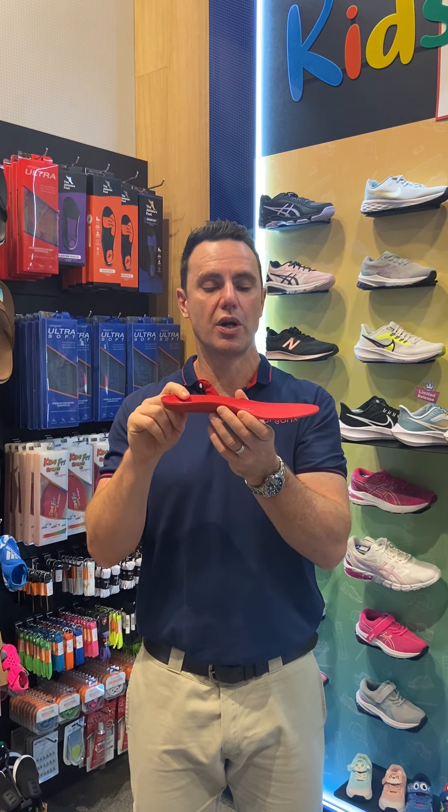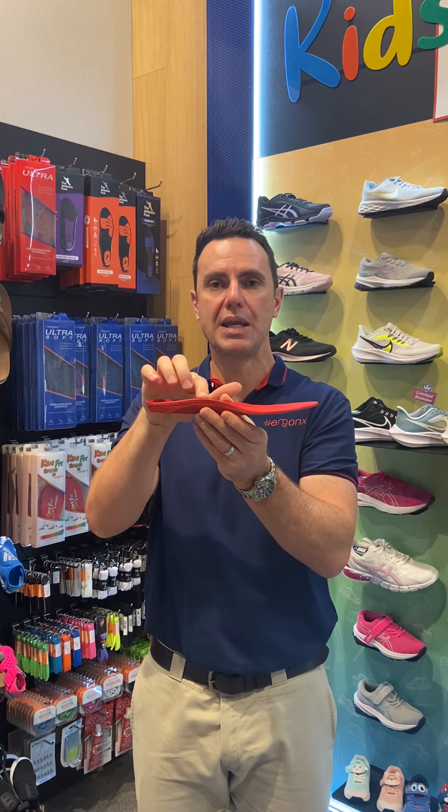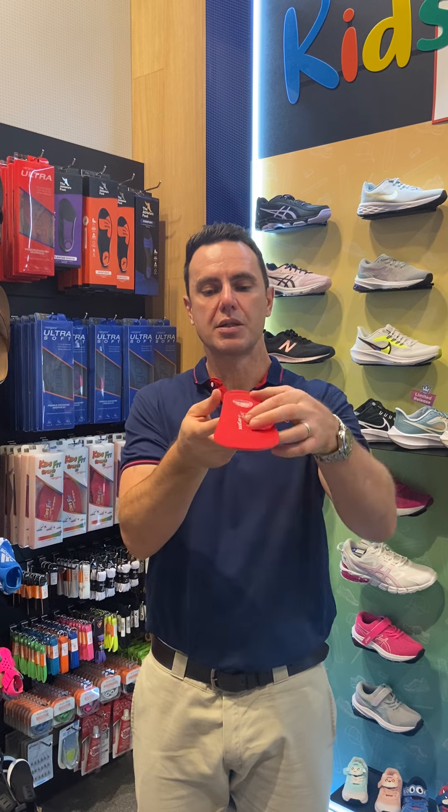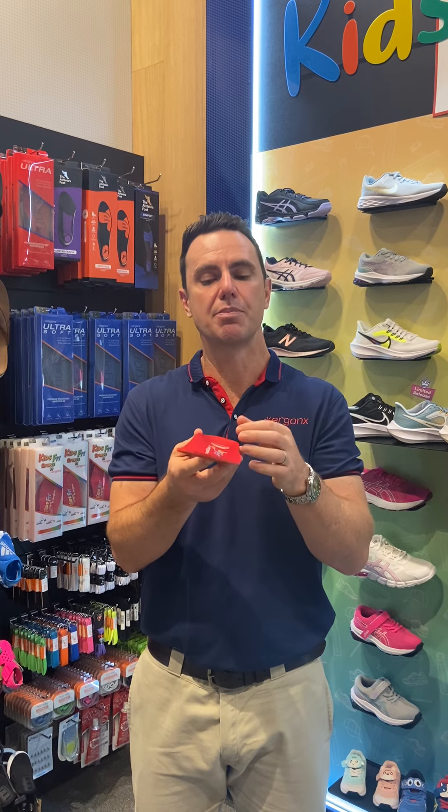The features that we look for in an orthotic inner sole to help support a child's foot — it's got this really nice, long, high medial arch support. What that does is it helps to stop your child's foot from rolling in too far, which will make your child's foot more comfortable across the school day and less likely to get aches and pains.